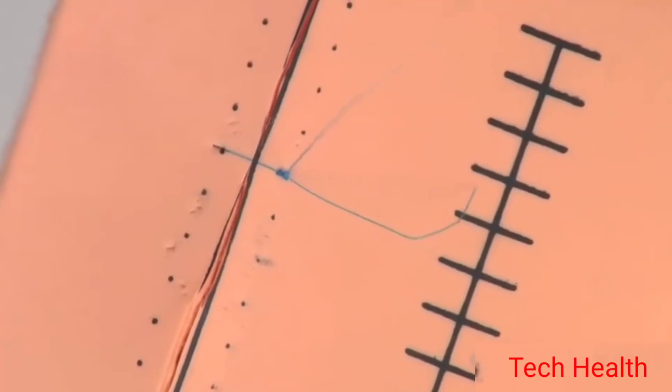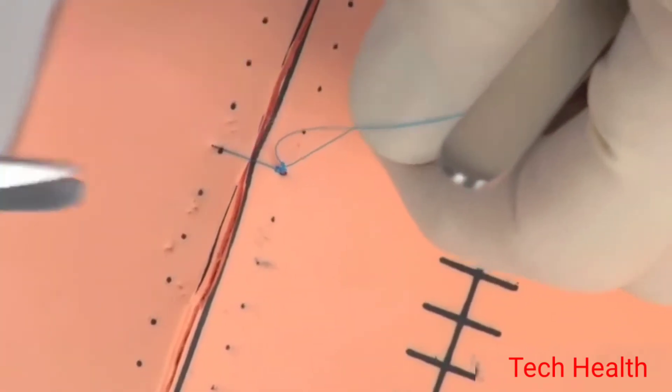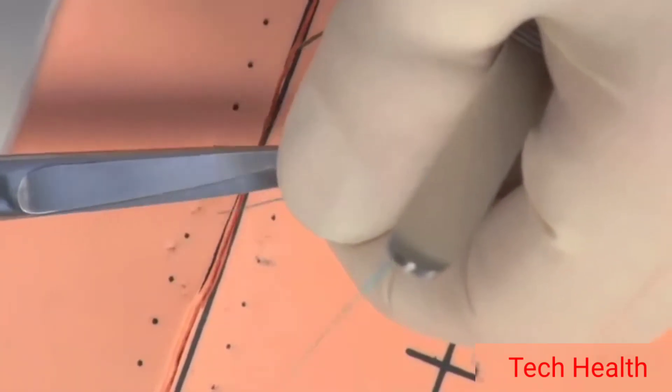When you are done, bring the knot outside the wound and cut it with the scissors. Now, practice this ten times.